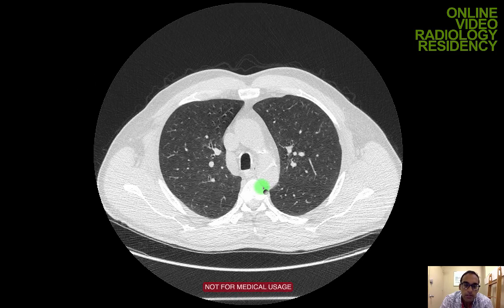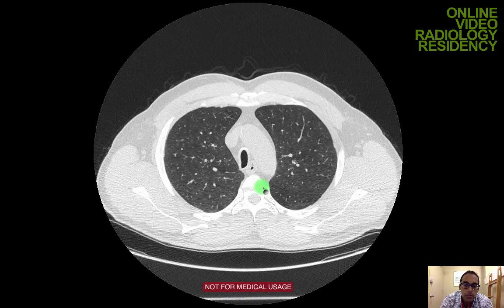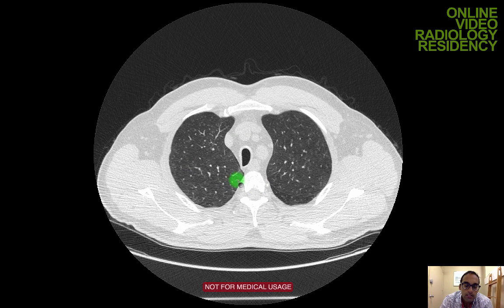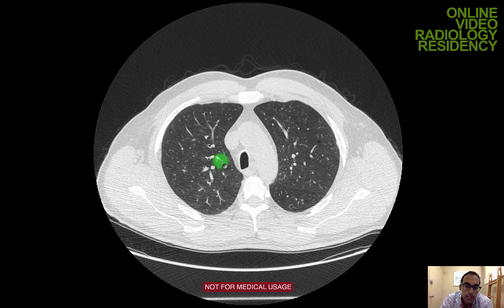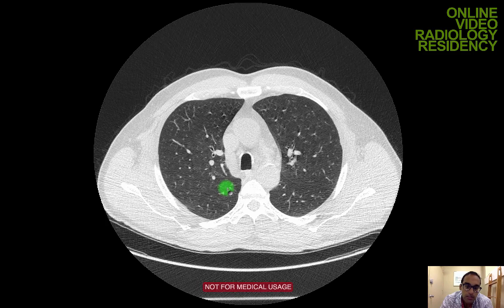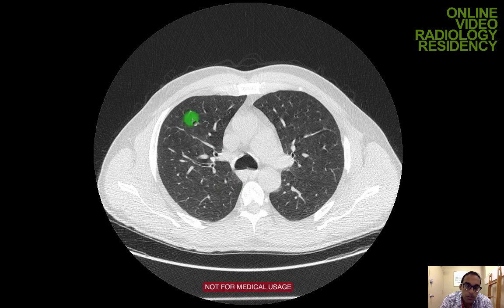Starting with the lung parenchyma — I'm on thin sections, lung windows of the axial imaging set. Confirming normal anatomy: it should be an air-filled structure, dark on CT, with branching structures within which are the vessels — pulmonary arteries and pulmonary veins — tapering nicely out to the periphery.